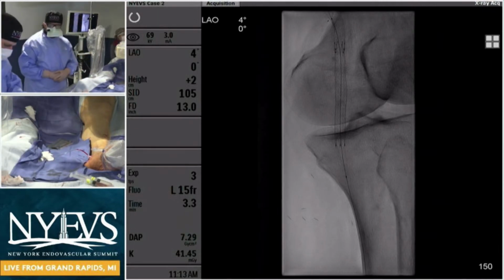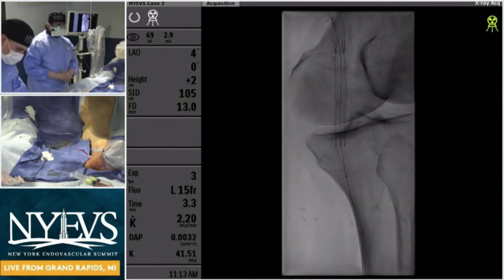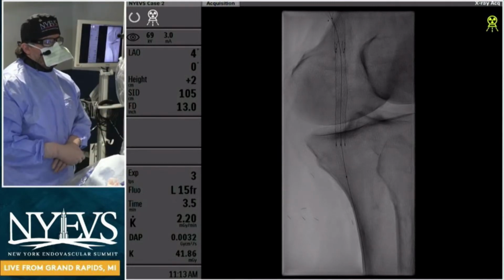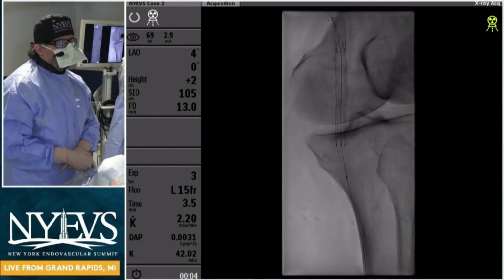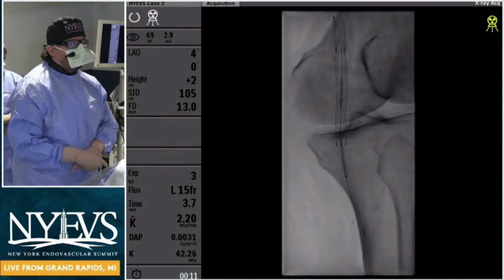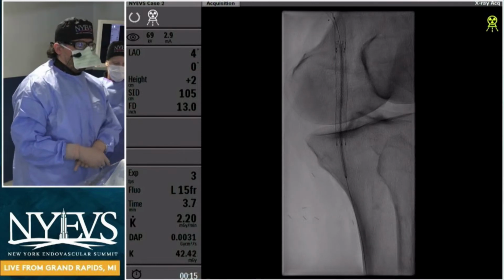Yeah, so I think these are all great, reasonable choices. I usually would do thrombectomy if it's a CTO. This one is not a CTO, and the presentation is not necessarily acute. So I don't think it's a wrong choice. I'm just saying I don't feel very strongly about thrombectomy. But because it's in-stent restenosis, I'm going to use the Excite ISR data. So I'm going to use laser atherectomy followed by balloon angioplasty, and possibly drug-coated balloon angioplasty, like one of the panel suggested.